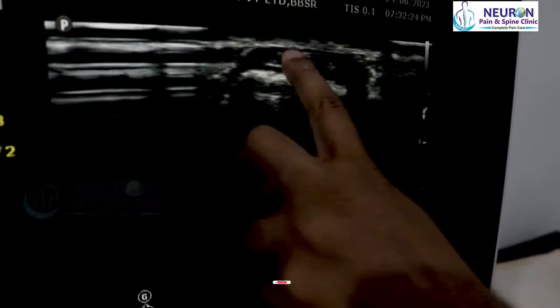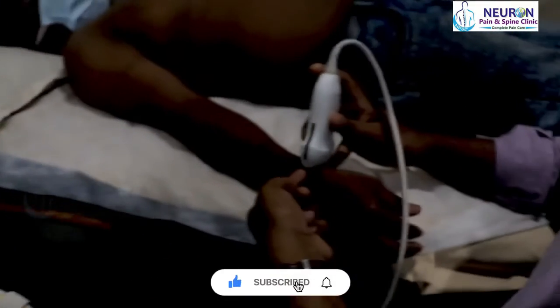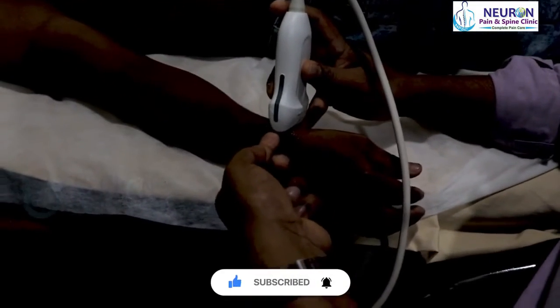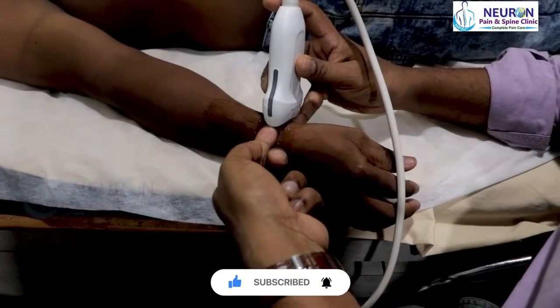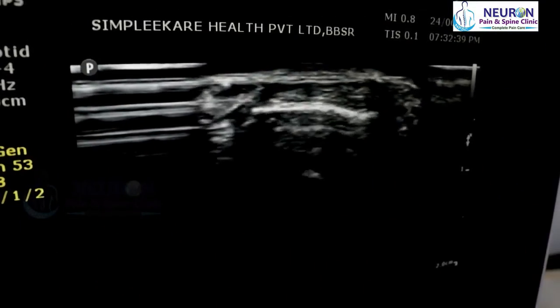For de Quervain's tenosynovitis, we put the needle just below the probe and target just below the tendon sheath, going from one side to the other.